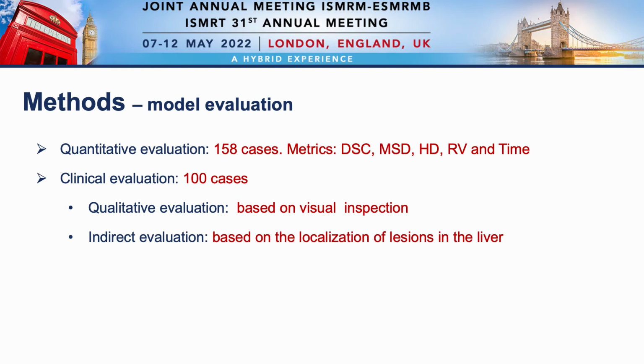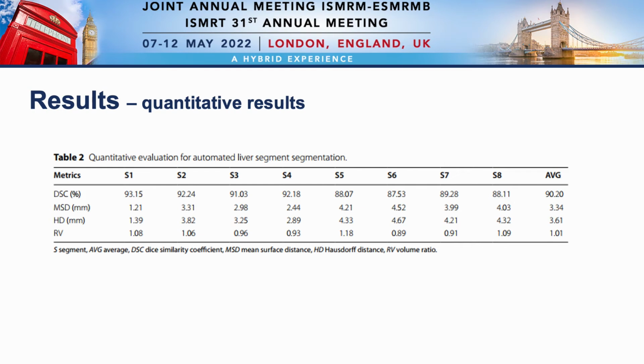As a result, the quantitative result demonstrates that our method has high accuracy with an average DSC of 90.2%. Good results were also achieved in other metrics.